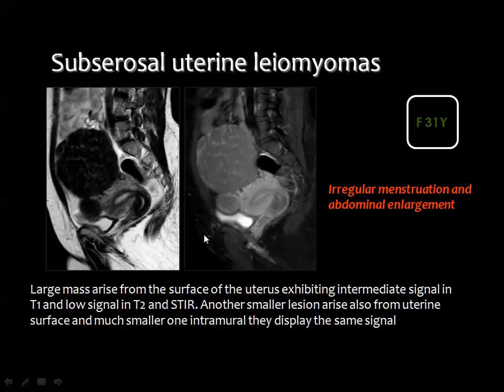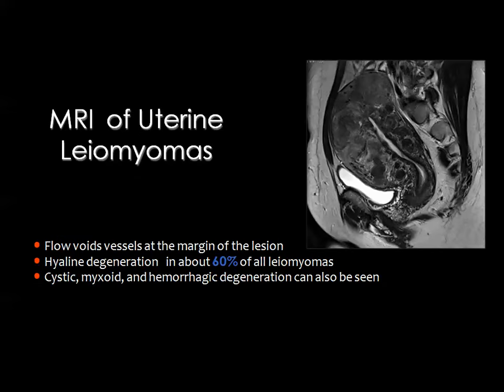A large fibroid in the fundus and a smaller adjacent one both show dark signal on T2-weighted images and enhancement after intravenous contrast on T1 fat-suppressed images. Uterine fibroids may show signal void vessels at their margin due to their vascularity. They may undergo hyaline, cystic, hemorrhagic, or myxoid degeneration, all of which alter the signal intensity of the fibroid mass.